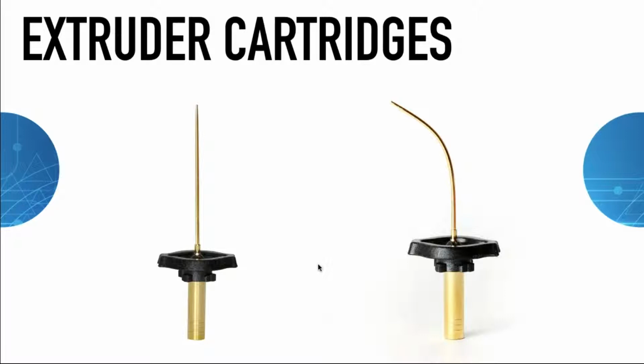And when you start condensing the gutta percha, it's not tacky. It doesn't stick to the pluggers. So the ability to pack it, get a good 3-dimensional seal, and have total control in your hands, you're able to do that with the 23 gauge needle and heavy body gutta percha.